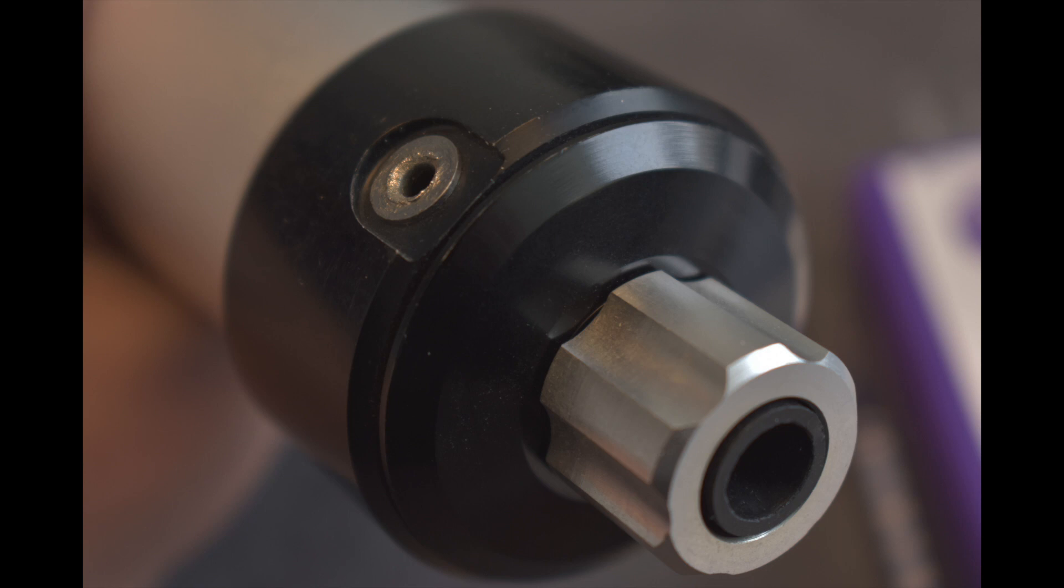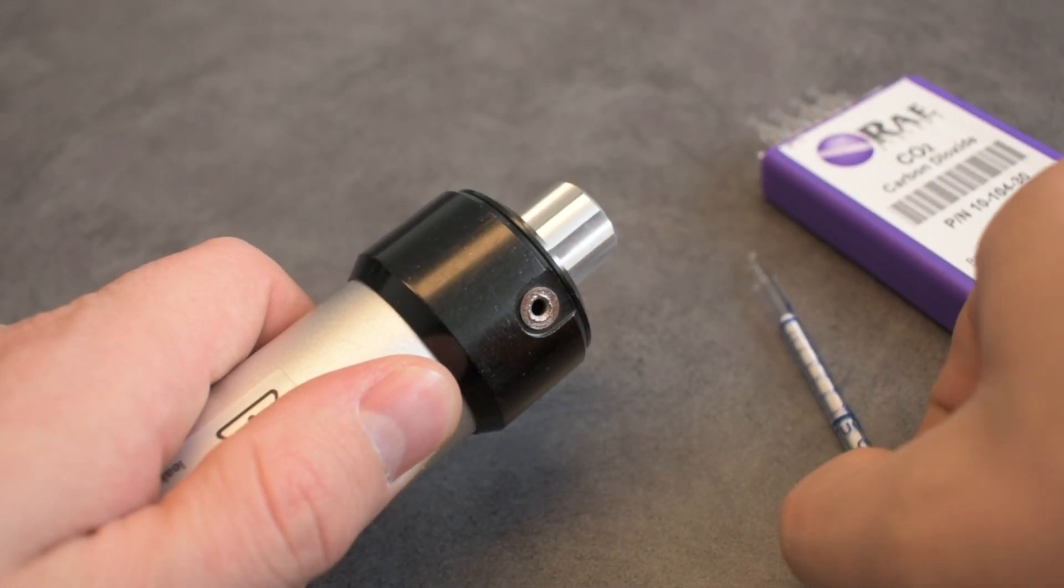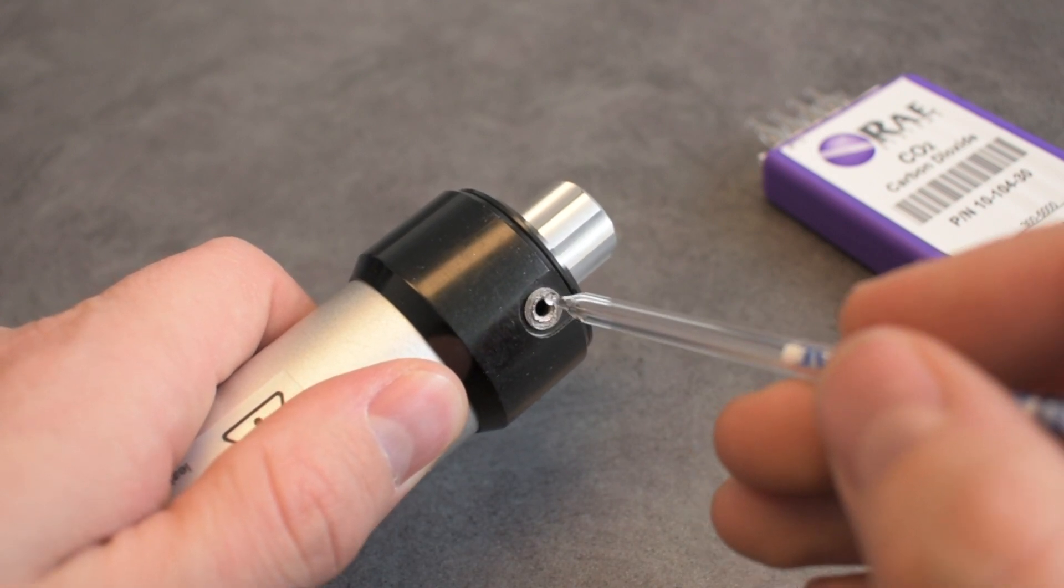The hole located on the side of the pump near the inlet is the tube breaker. Place each end of the tube into this hole and break the tips off.